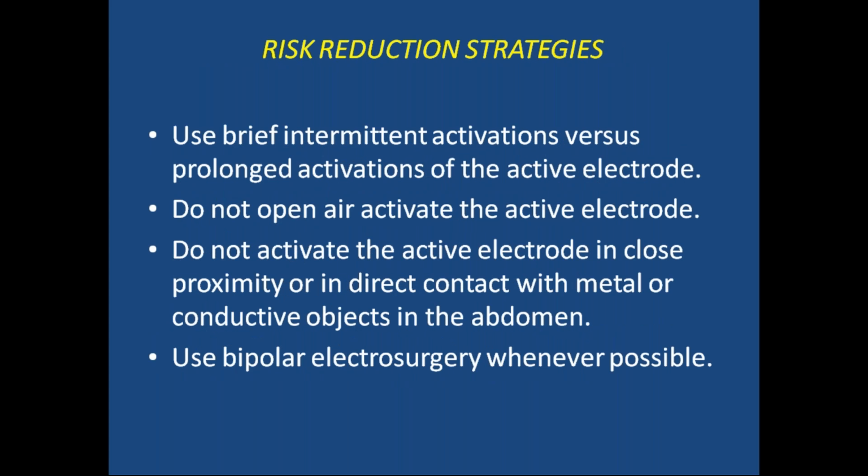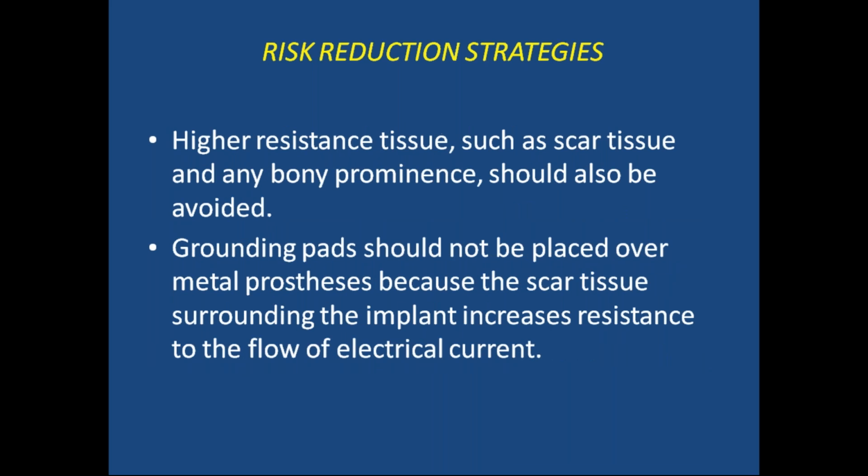So use brief intermittent activation versus prolonged activation of the active electrode. Do not open-air activate the active electrode, and do not activate the active electrode in close proximity or in direct contact with metal or conductive objects in the abdomen. Use bipolar electrosurgery whenever possible.